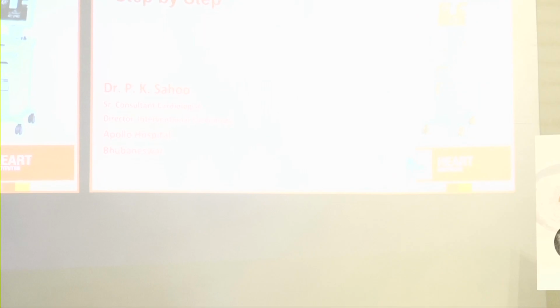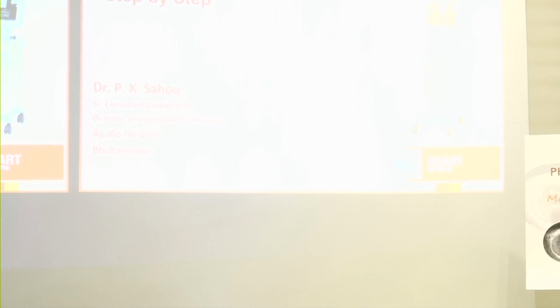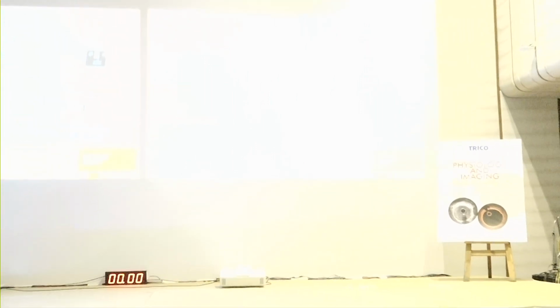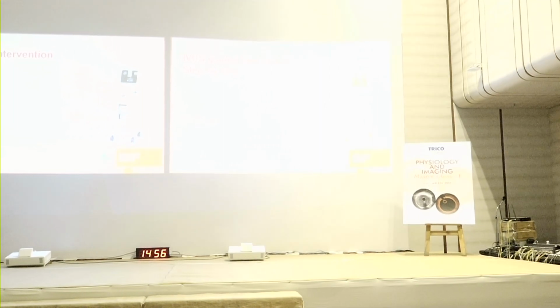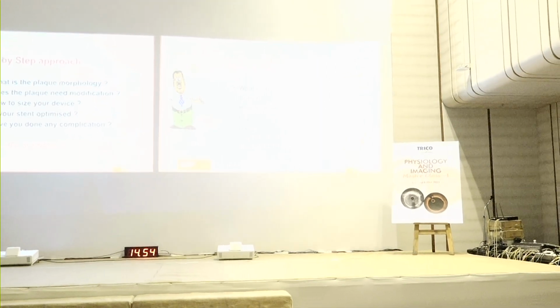A very good morning to everyone. In fact, I have been assigned to talk on the role of IVUS step by step. So this is something very basic that I'll be talking on, how to do an IVUS guided intervention step by step. Because it is very important, it is not just pushing a catheter inside and then taking it out. We have to see what is to be done.